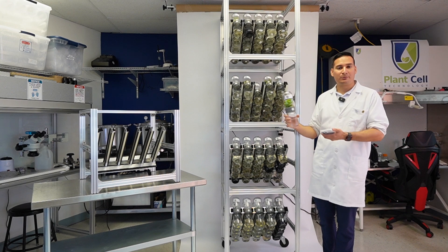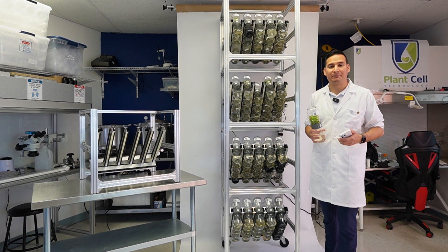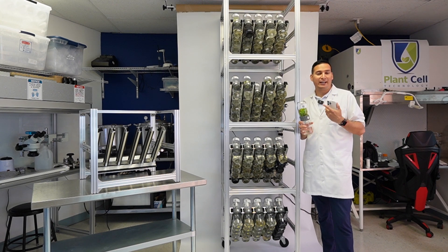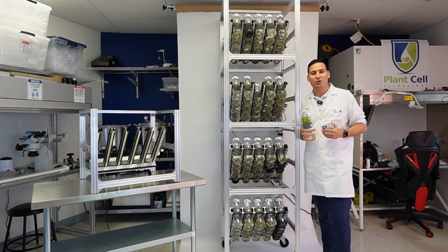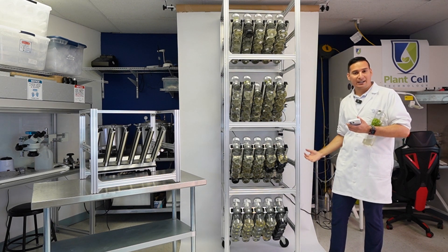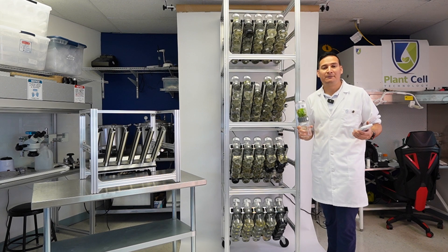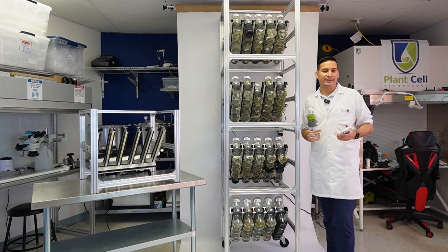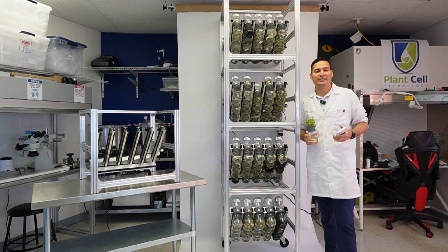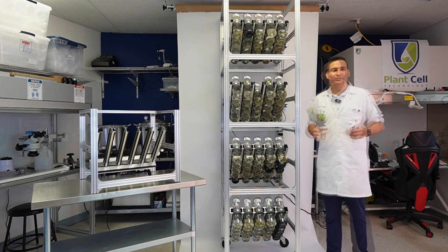Let me give you an example. Say one biocoupler produces 500 plants per year. One BioTill has 25 biocouplers — that's 12,500 plants in one year. Selling those at just one dollar each gives you a return on investment of over 300%. With four BioTills — 100 biocouplers — that's 50,000 plants per year, and at one dollar each, that's $50,000 you can make in one year.